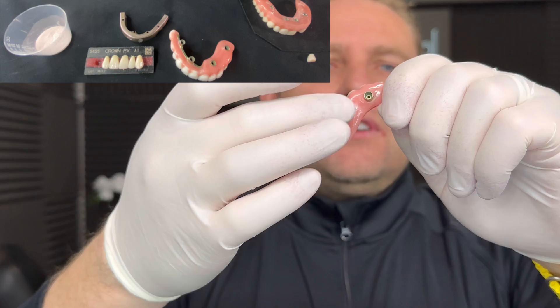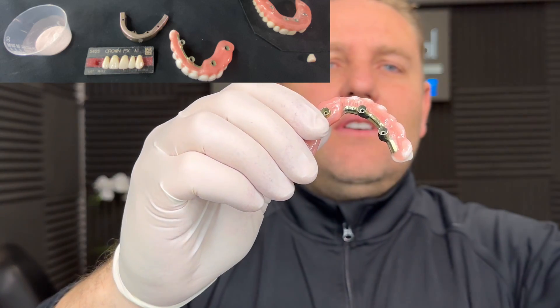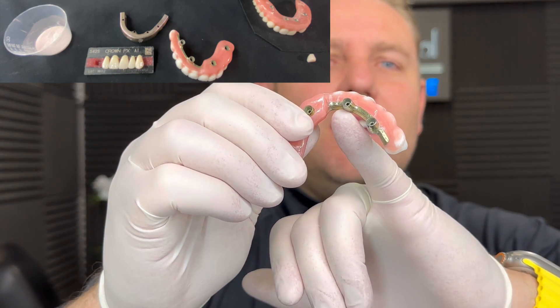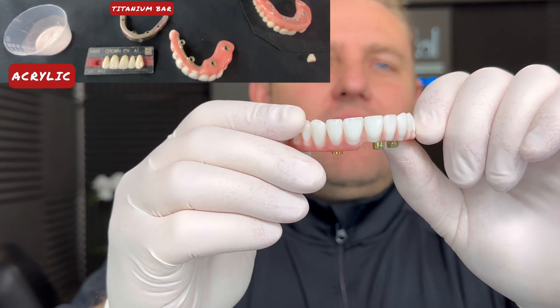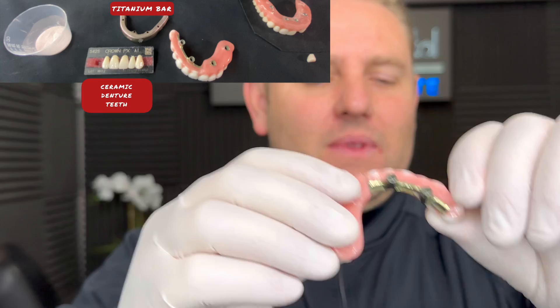Luckily, we're in a place where I can show you a titanium device. So this is one side of it here. On the other side, if I remove this acrylic layer, this is what we have here. And you can see the titanium bar inside. It's surrounded by acrylic. And then on the outside, you have ceramic teeth.